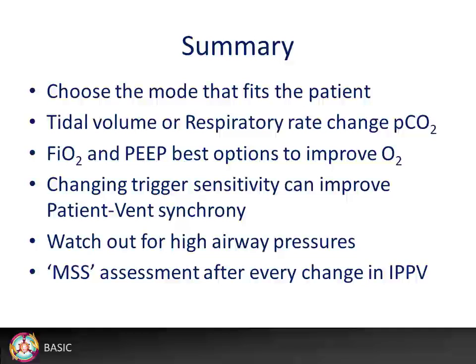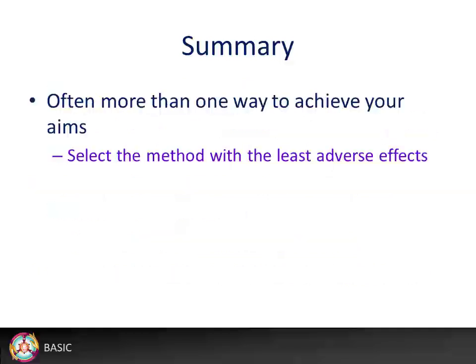Watch out for high airway pressures. Do a MSS assessment after every ventilator change. There is often more than one way to achieve your aims. Select the method with the least adverse effects.